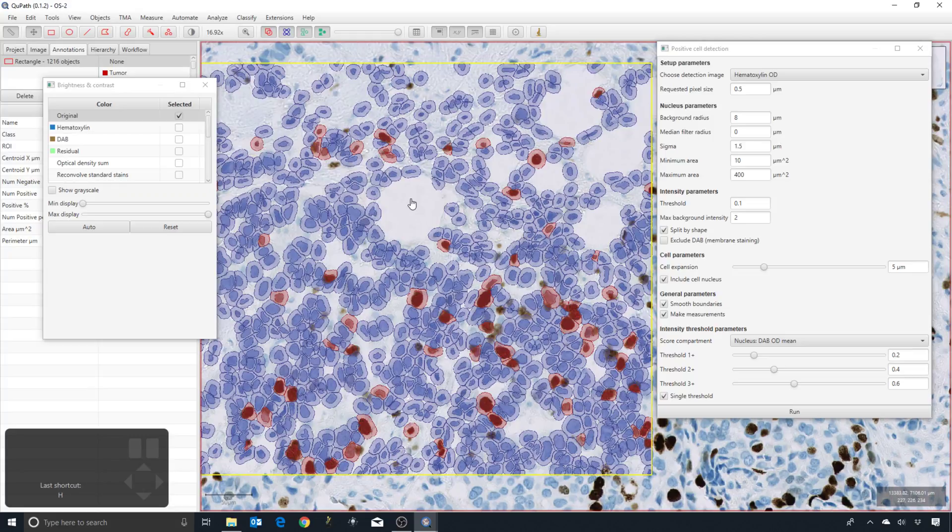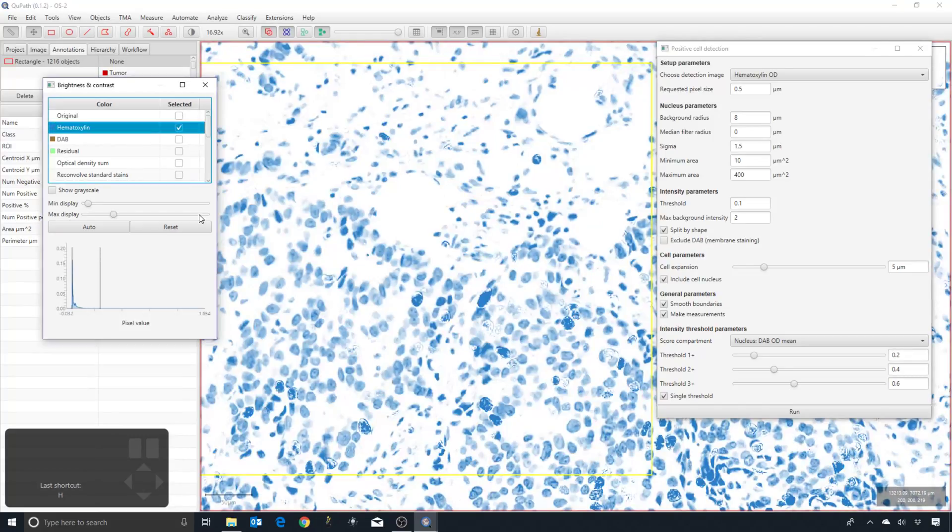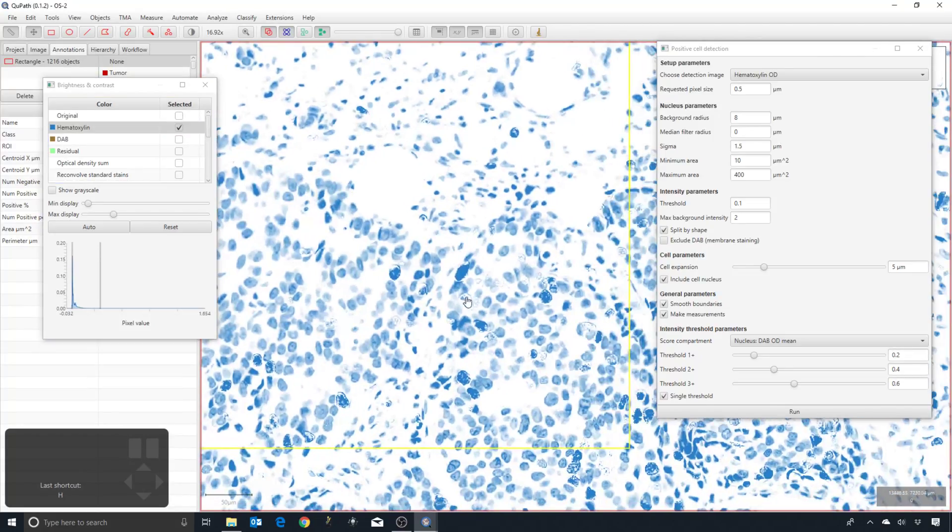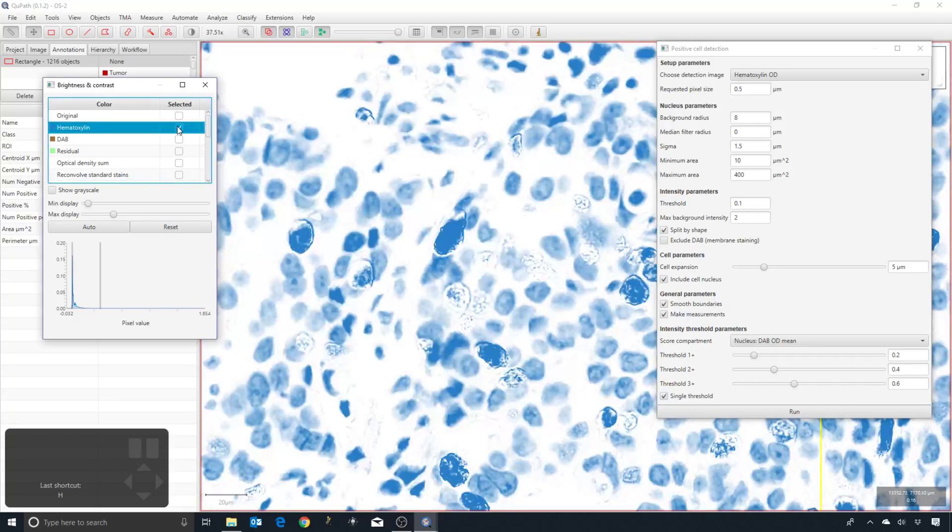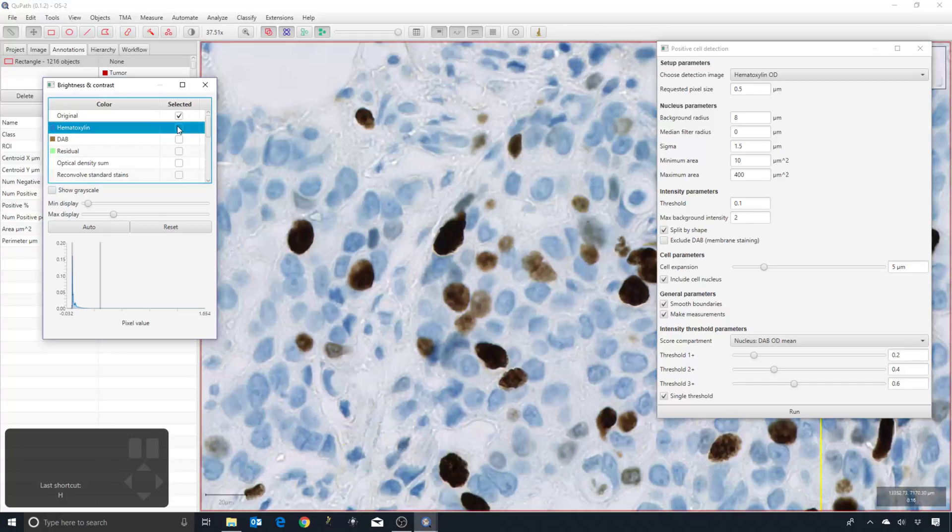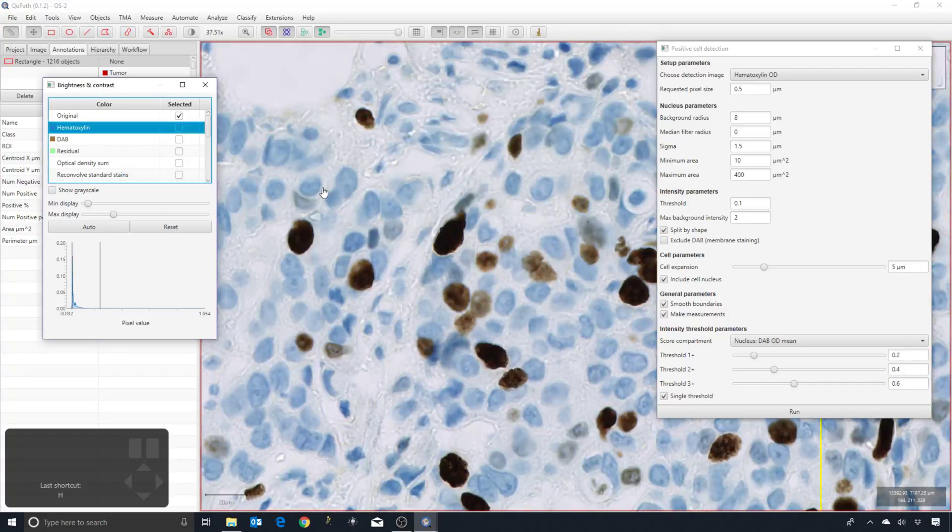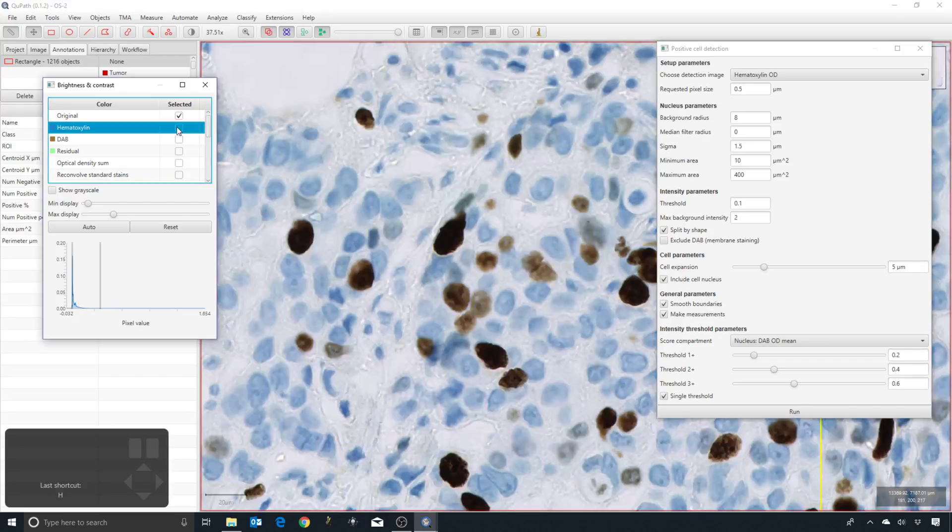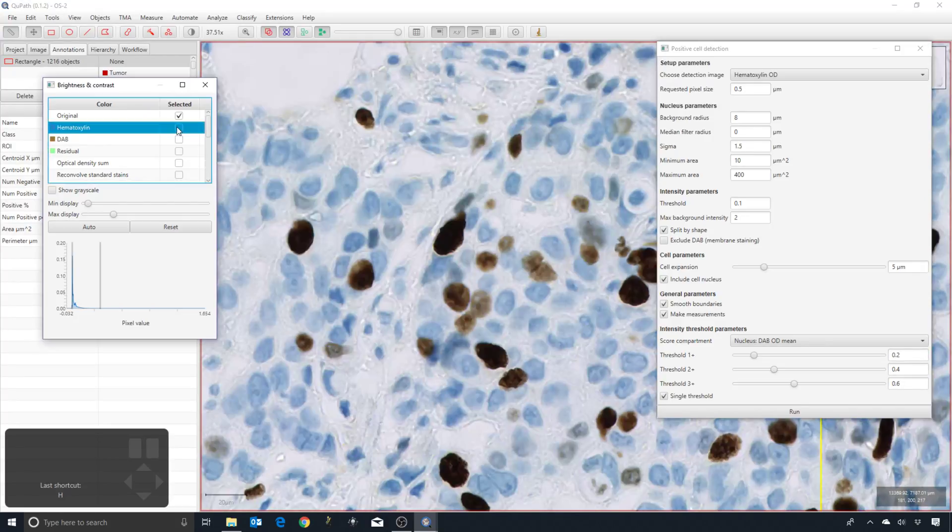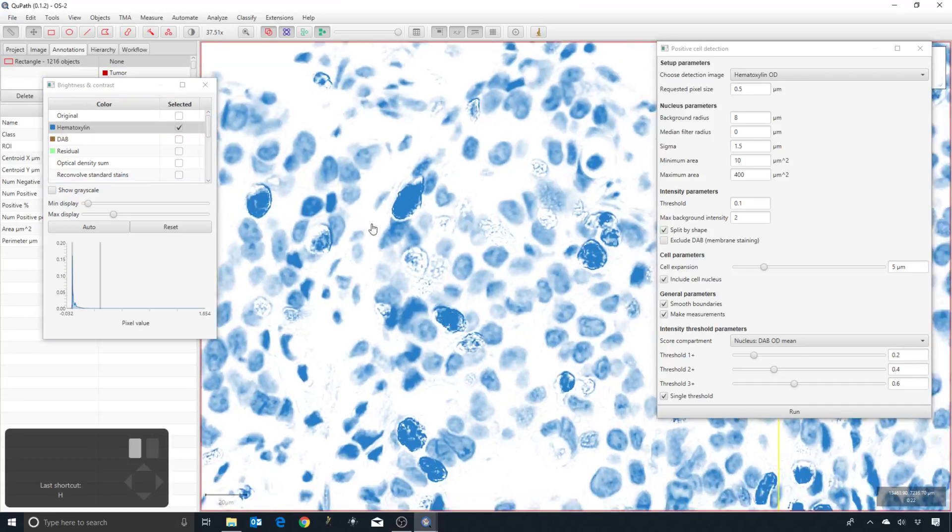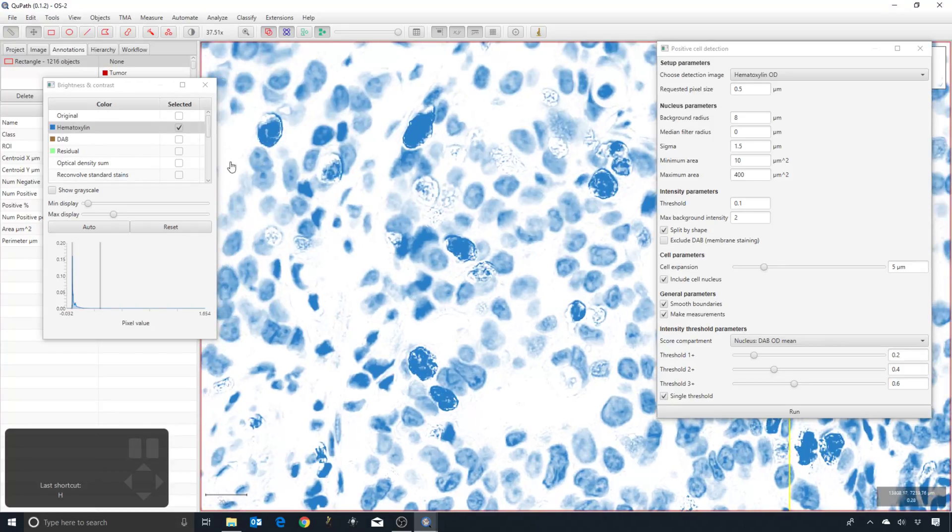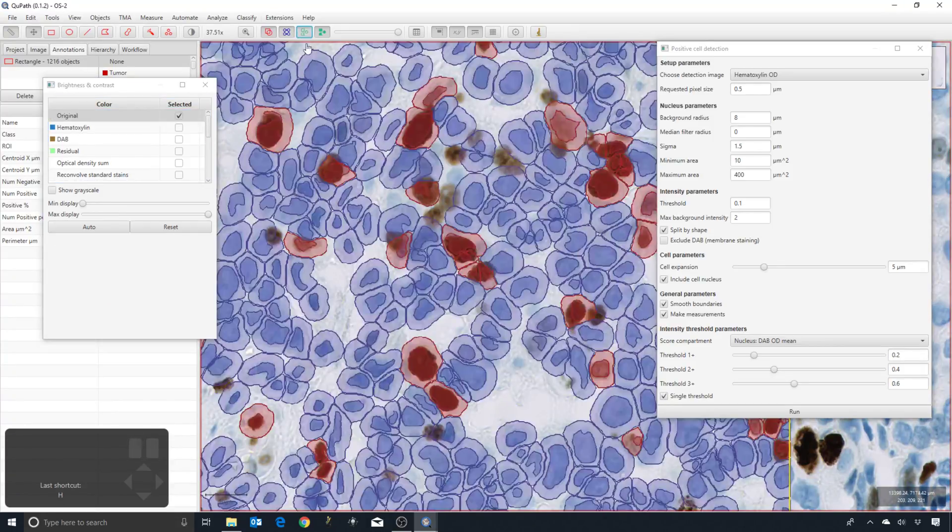So I'll press H to hide, and I can view what the hematoxylin looks like. If I turn this on and off, you can see that for a lot of these brown nuclei, there's very low values after the stain separation in the hematoxylin channel. This explains why they're either not detected or the highly textured areas within them indicate why they might be fragmented into multiple nuclei as opposed to one single nucleus.